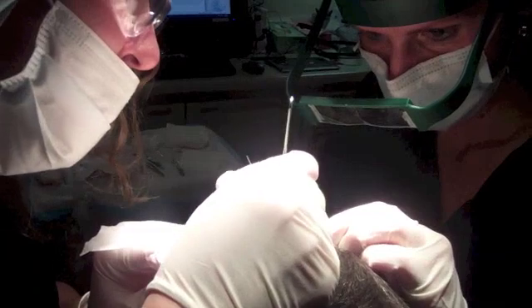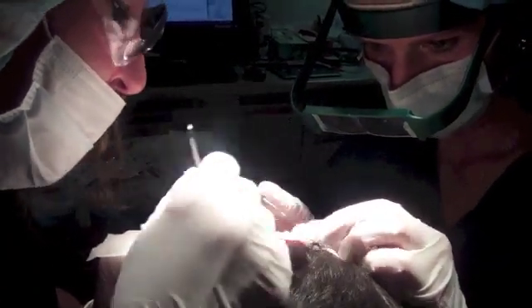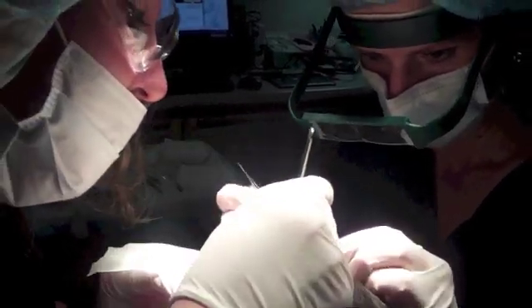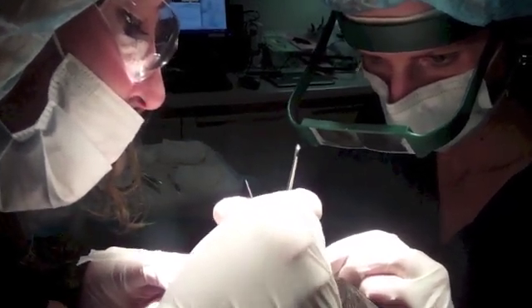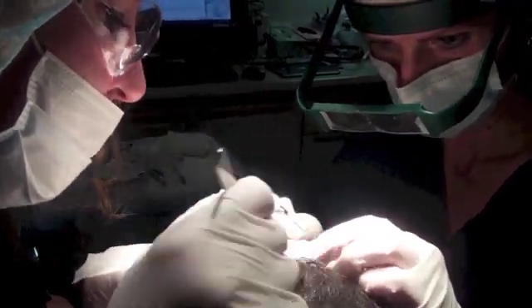One thing I want to reiterate is that we did use the micro punch technique, which is really great. It's easier placing, it takes down some of the bald scalp even further, and it really fits the robotically harvested grafts much better. I think Clay's going to have an amazing result — things are going really well. This is definitely the downhill.